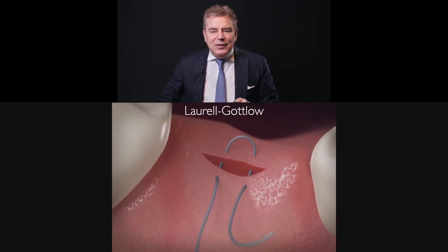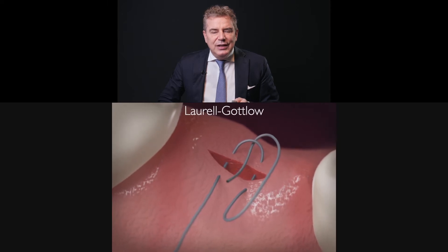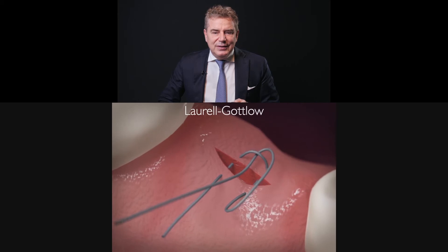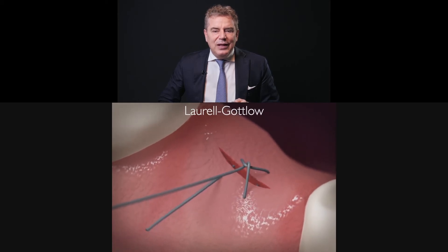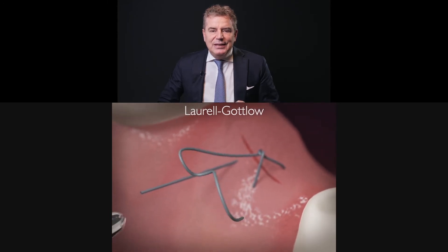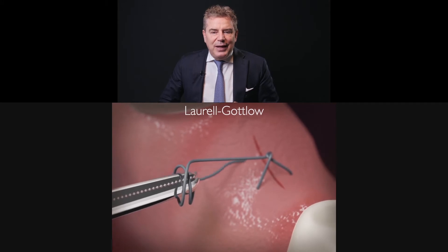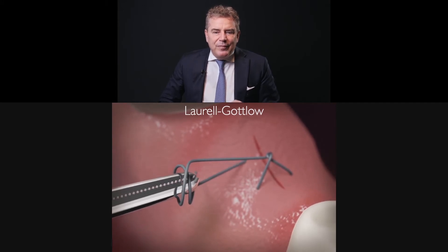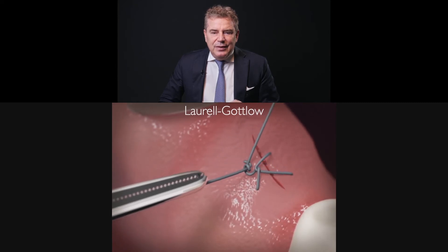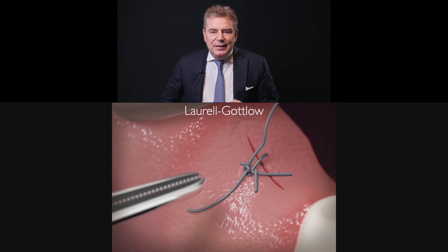As you can see, this is the internal mattress suture part, and then you engage the loop, and then you close. This is the Laurell-Gottlow. Of course, you need to stay at least three millimeters from the incision margin. Again, this is a video from my app that you can download — very cheap. And this is the closure.